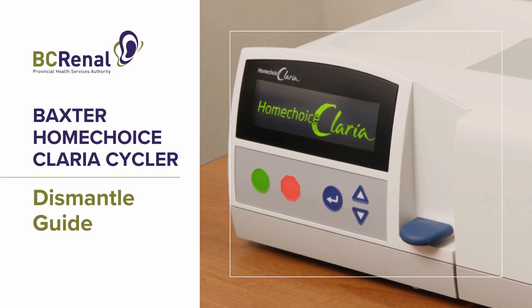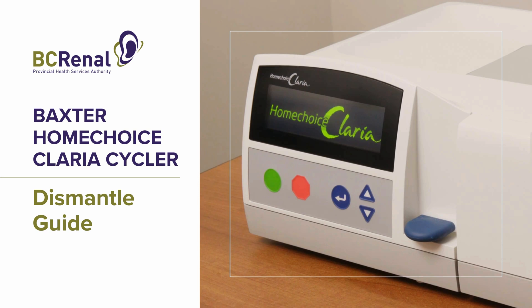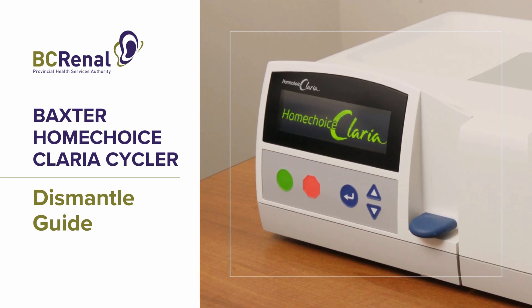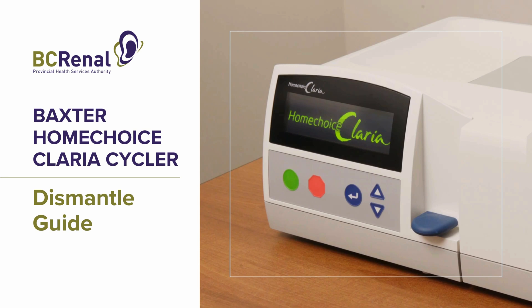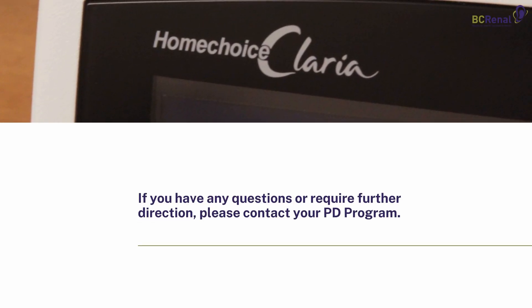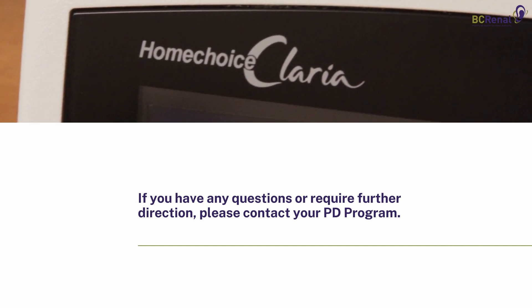The following video demonstrates the steps involved with dismantling the Baxter Home Choice Claria Cycler when therapy has been completed. The content of this video is meant to supplement training provided by PD programs in BC for patients using the Claria Cycler. If you have any questions or require further direction, please contact your PD program.